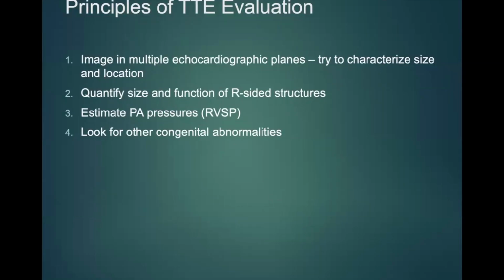Because a lot of the indications for intervention are the symptoms that patients experience or the remodeling changes that happen in the heart, it's really important to look for complications of ASD, because that's often the first clue that can then trigger you to look at the intraatrial septum a little bit more carefully. And so isolated dilation of right-sided structures in someone who's young and has no other real reason for chamber dilation really should prompt you to interrogate the intraatrial septum a little bit more carefully, both with color as well as agitated saline.